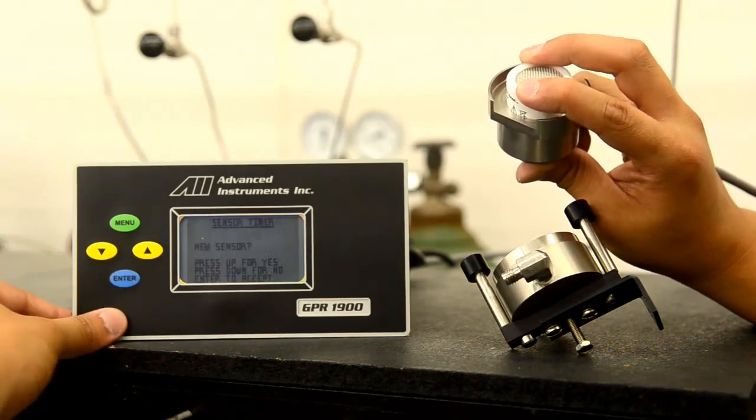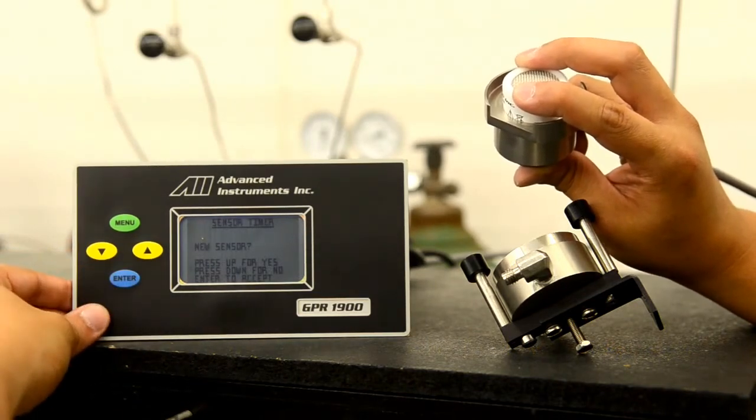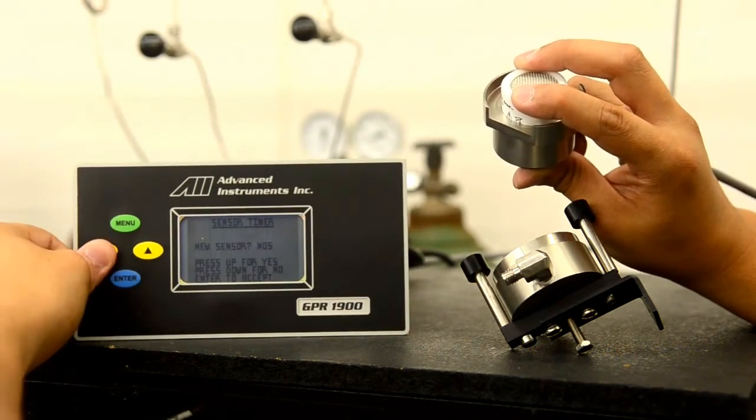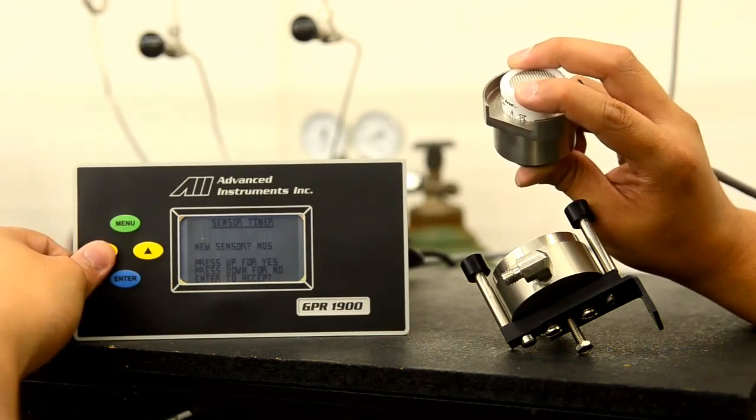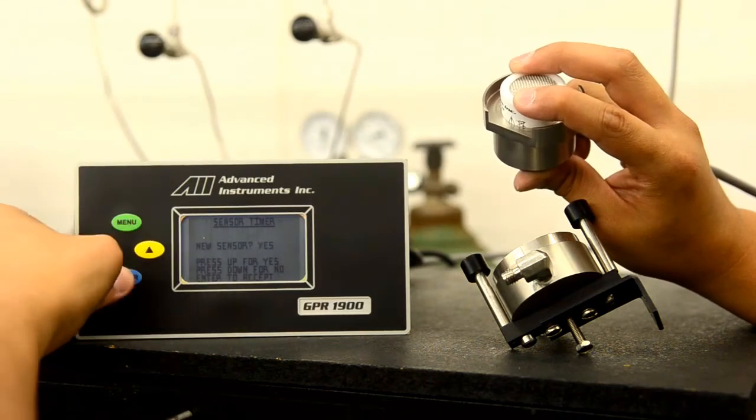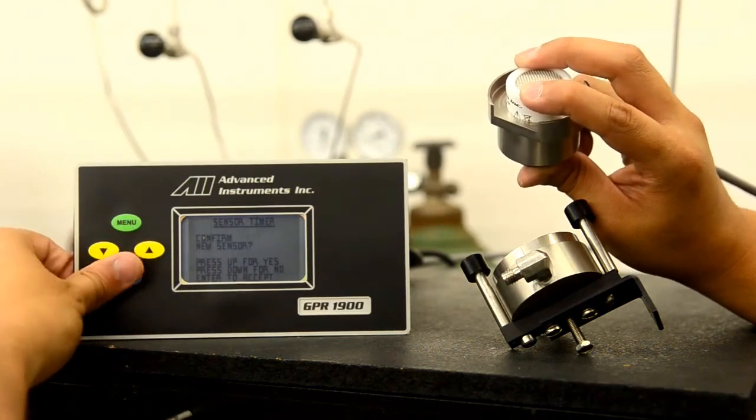We select enter and are prompted if this is a new sensor. Select up or down for yes or no. If this is a new sensor install, be sure to select yes. If this is a calibration on a current sensor, select no. You will be prompted to confirm your selection.